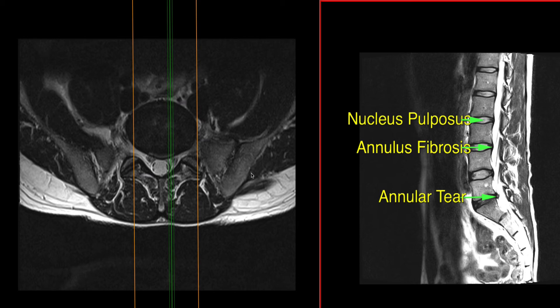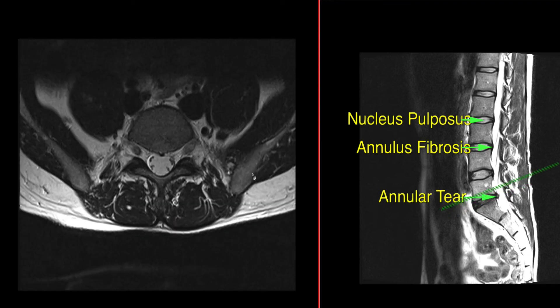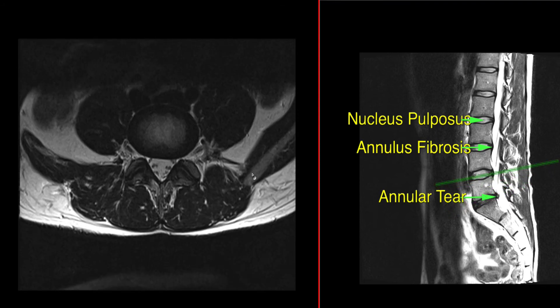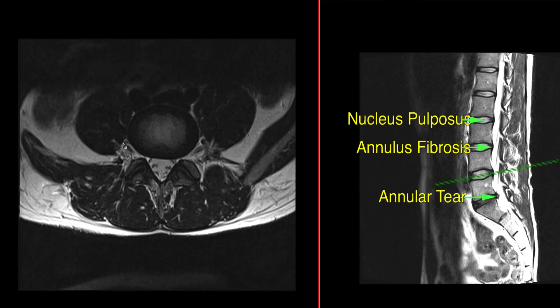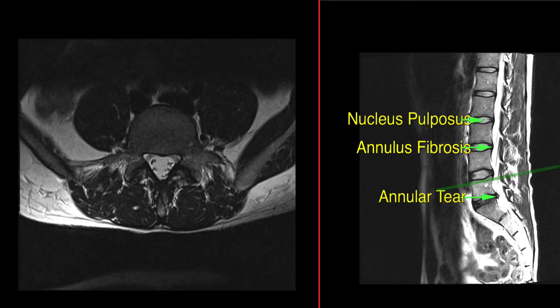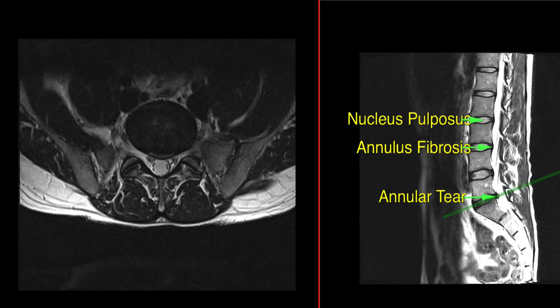If we click over here on this image on the right, we're going to scroll quickly up to the L4-5 level to look at a normal level. Here's the intervertebral disc, the spinal canal behind it, and we're going to scroll down now to the L5S1 level where this is the annular tear.